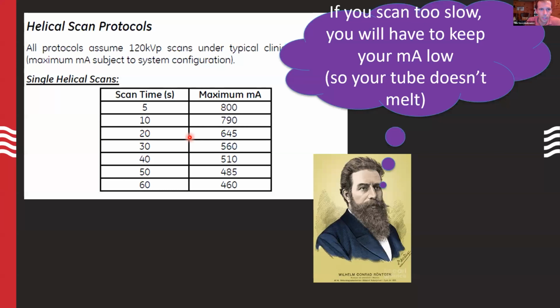All right, so the next comment I wanted to make is, if you're going to get anything from my talk and go into the clinic and really implement some of this, there are some other things we've got to know about. And that is that if we scan for too long, we might also have issues with our tube output because we can't use high mA limits, right?